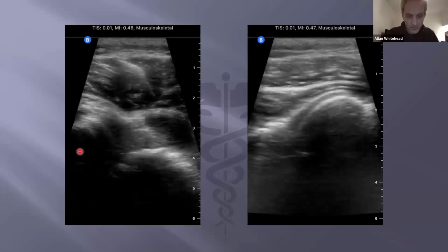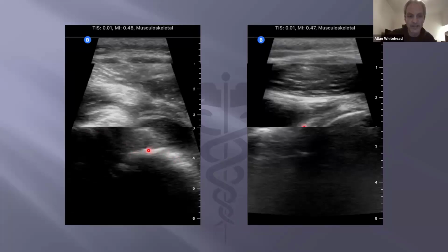Another case, I think we've got 2 or 3 more examples, just so you keep seeing the same sort of things, reinforcing it. Again, handheld device. The glenoid is sitting in here. Sometimes when you're doing this in real time, it's a bit easier to see than trying to capture the perfect image, but it's either that line or that line. It's one of these 2 lines here. You can certainly see the nice curved humeral head, and then there's this vacant joint space here. Looks a bit gray and black, probably with a mix of blood clot and runny blood.